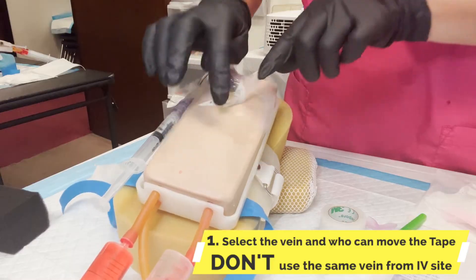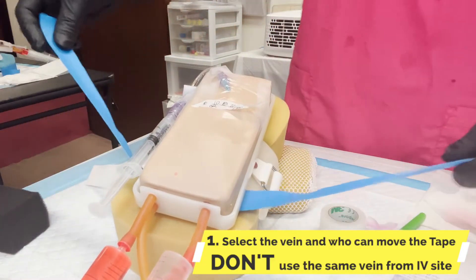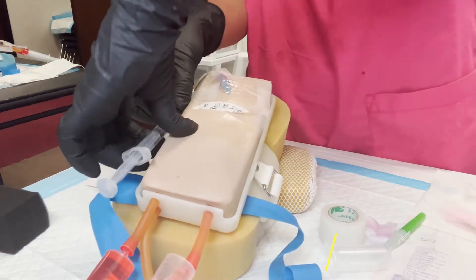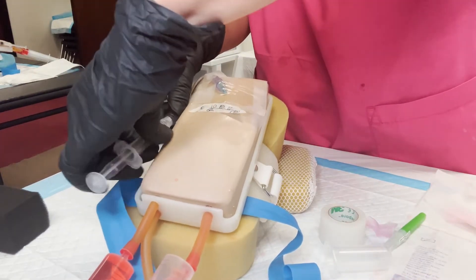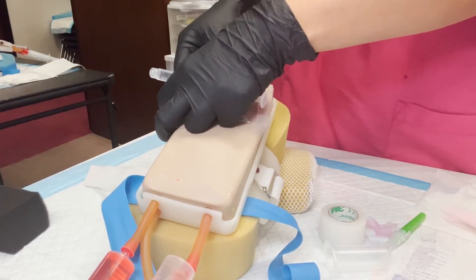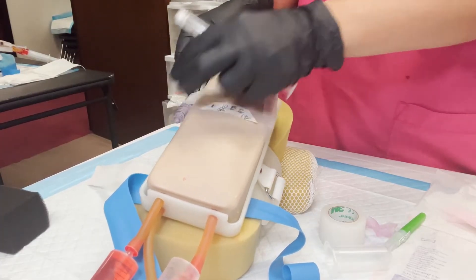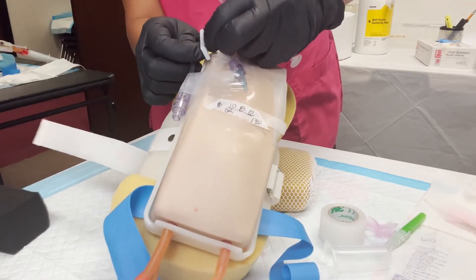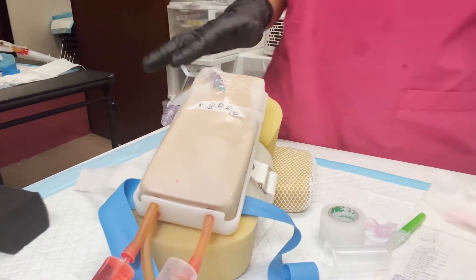So I have a side vein here that's good. Watch me. This is the time you can take off your syringe and you can lock it, because the patient really doesn't need a syringe unless, of course, you're giving meds. So you're gonna lock this here. And that's what we call a saline lock or hep lock.